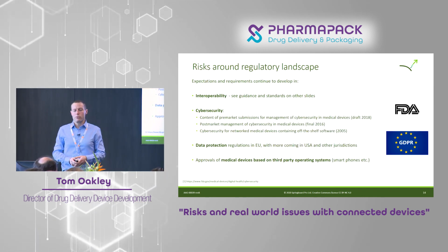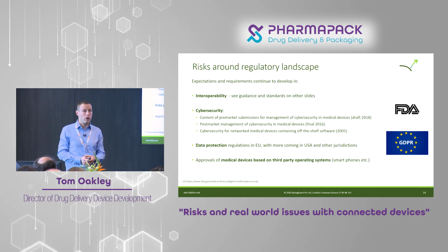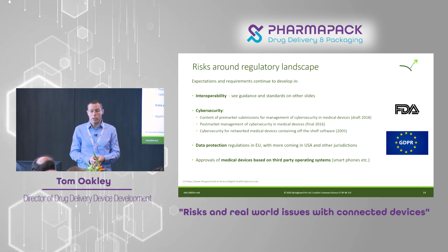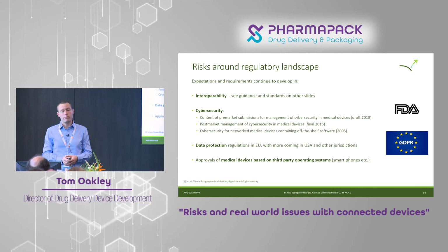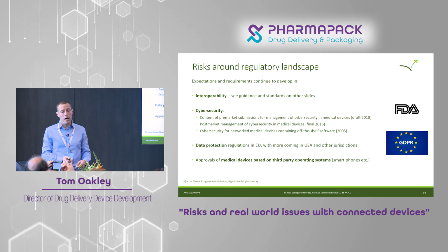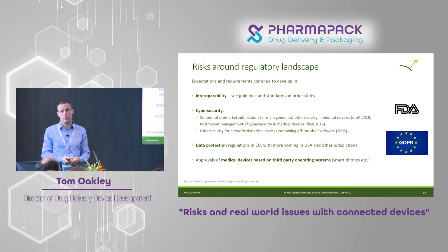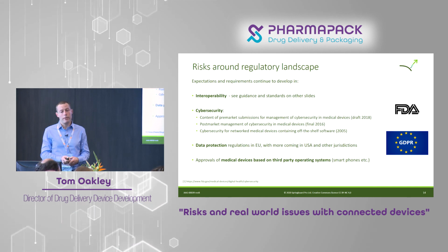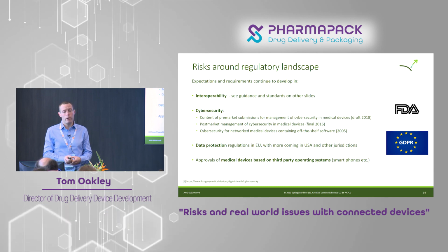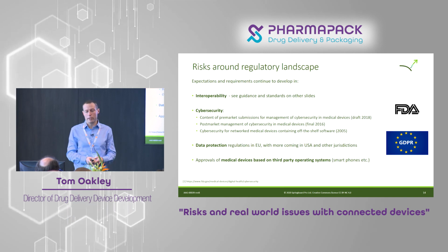We'll move now to risks around the regulatory landscape. We've talked briefly about interoperability, so I won't repeat that part. Cybersecurity we've only just touched on, but FDA has released some draft guidance to do with the pre-market submissions. They also have some final guidance out for post-market management with regards to cybersecurity. And there's also some guidance around cybersecurity for networked devices where you have off-the-shelf software and how to approve that.